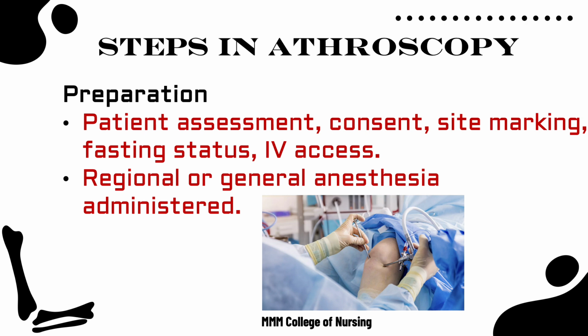In preparation, the nurse has to ensure proper patient assessment and that the consent is obtained. Site marking is done by the surgeon. Fasting status of the patient prior to the procedure. IV access, ensuring whether the line is patent. Regional or general anesthesia can be administered to the patient after consultation with the anesthetist.